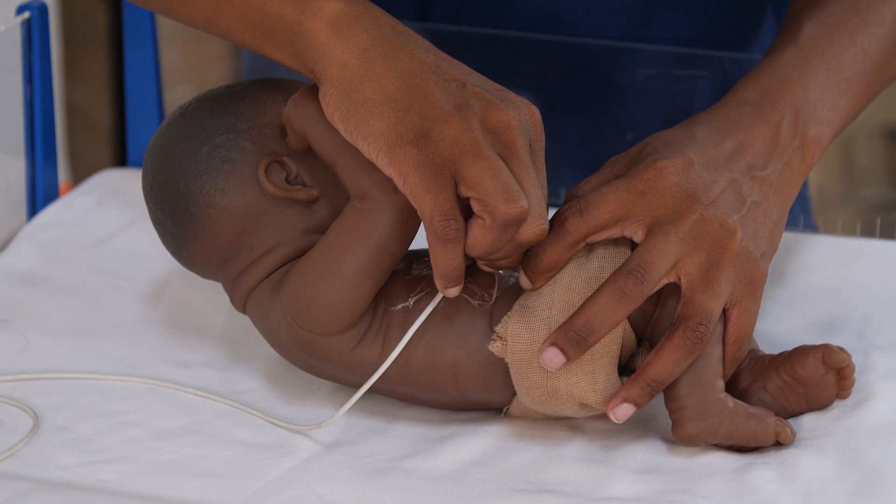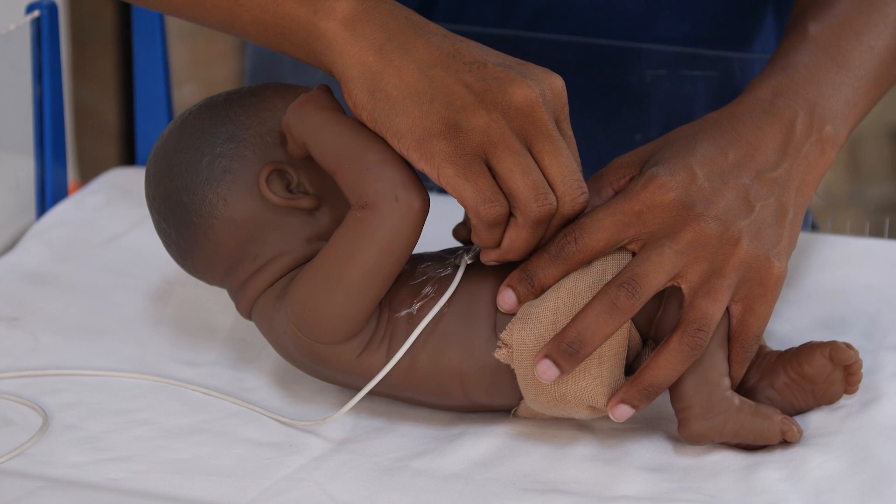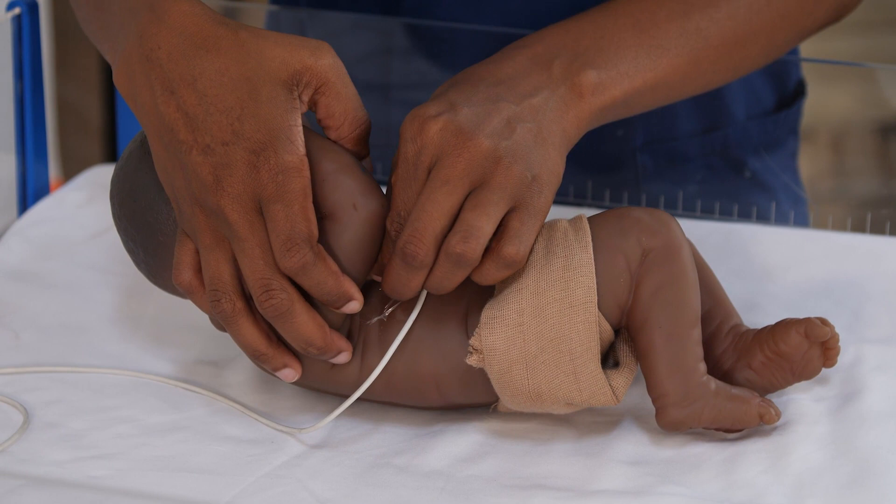It is quite sticky and strong, so you have to be very gentle. Gently remove the tape and make sure you do not kink the cord to avoid damage to the cord.